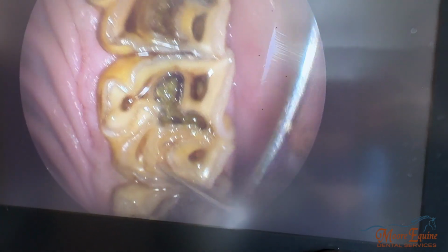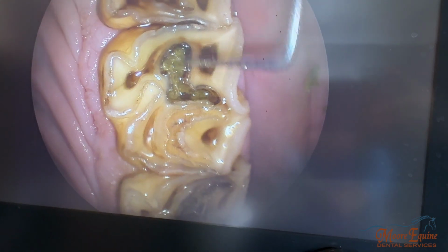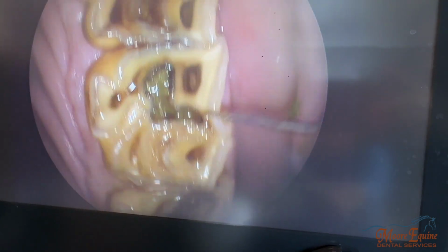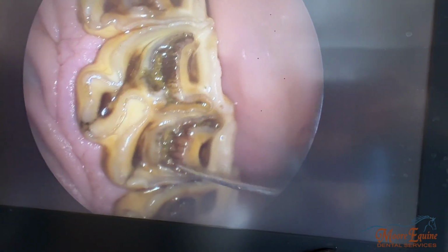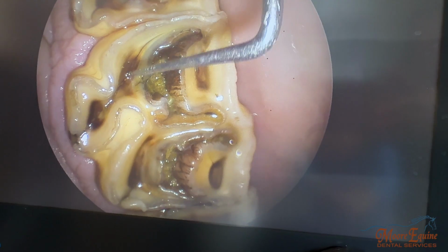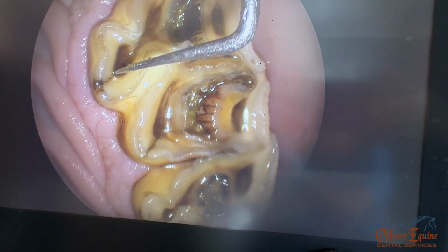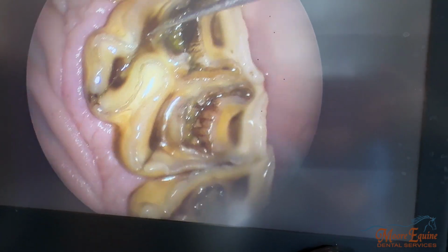We can see some of these, like this tooth here, might be okay because the infundibulum is pretty shallow, but some of these other teeth may benefit from fillings. Here we can see we have a deep fissure, so it's important to manage this. We'll do that in a different video, but there's ways in which we can manage the pressure on this tooth.